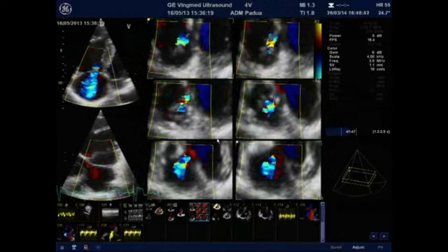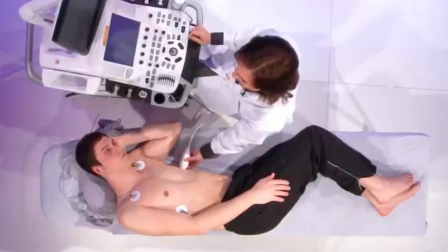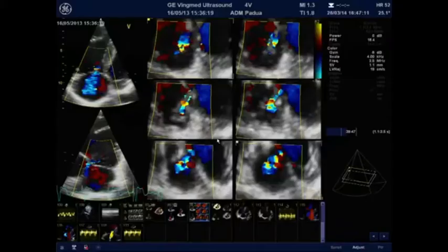Okay, so these are 6 equidistant slices across the tricuspid regurgitation jet, and you can appreciate that the shape of the neck of the jet is not round but has a slit-like appearance. And this explains why in several views, just by rotating the transducer a little bit, the diameters that you can measure in 2D may be very different.